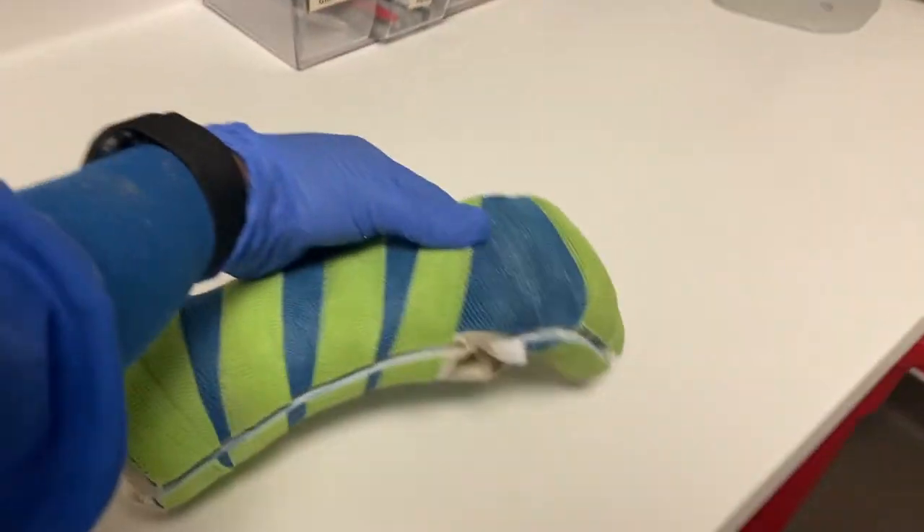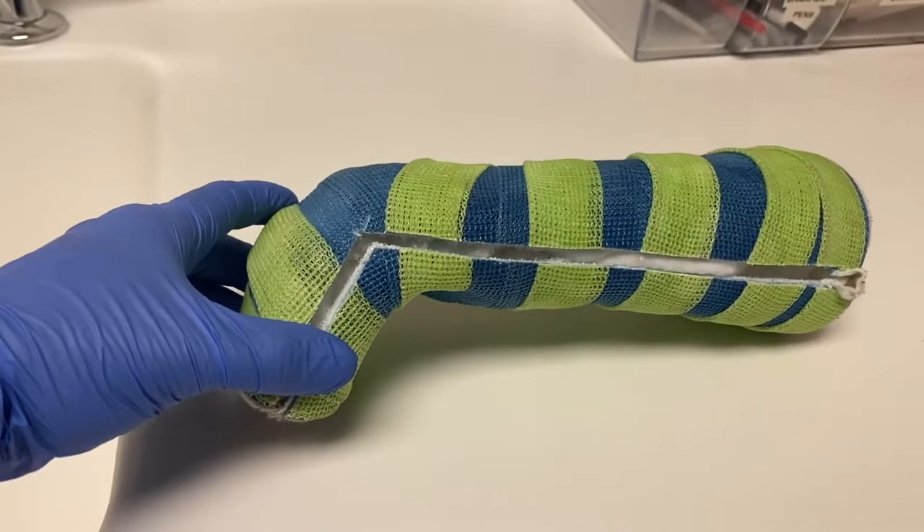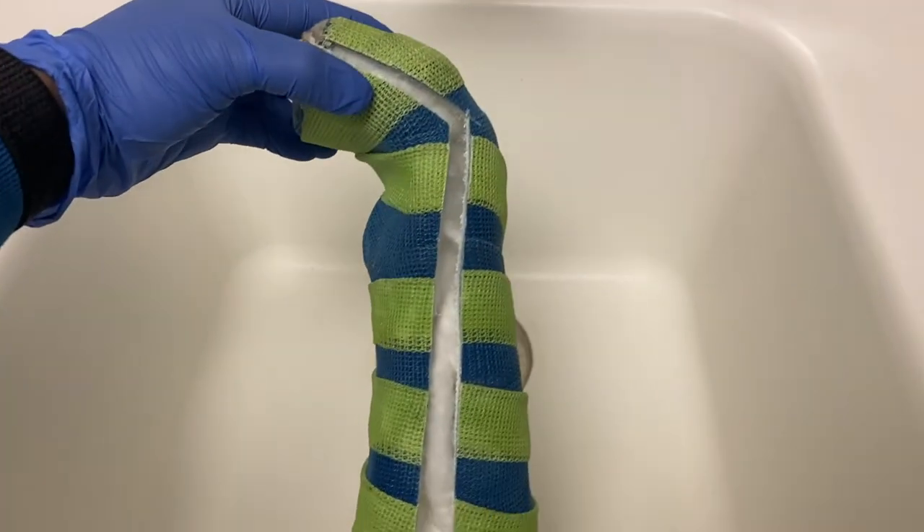I will actually be putting on the same cast for the same patient — they came in to get an X-ray and make sure everything is healing correctly, but they will unfortunately be going back into the same cast.